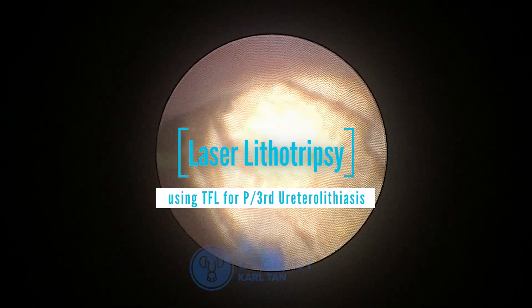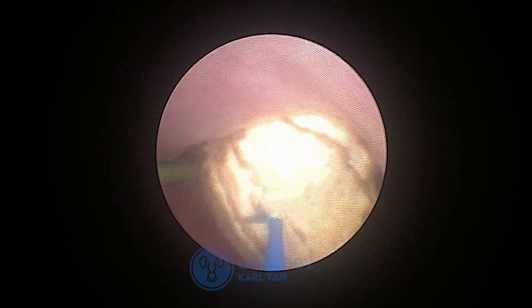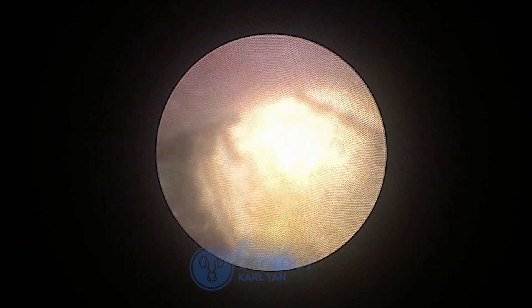We're doing a laser lithotripsy using a Thulium Fiber Laser for proximal third ureterolithiasis. This is a somewhat obstructing stone in the proximal third. The settings would be around 0.5 joules and 20 Hertz.